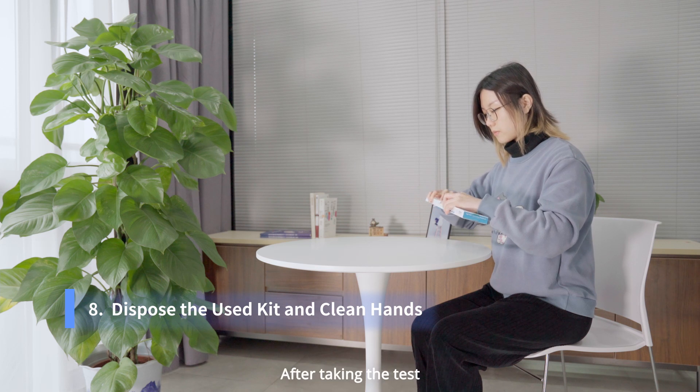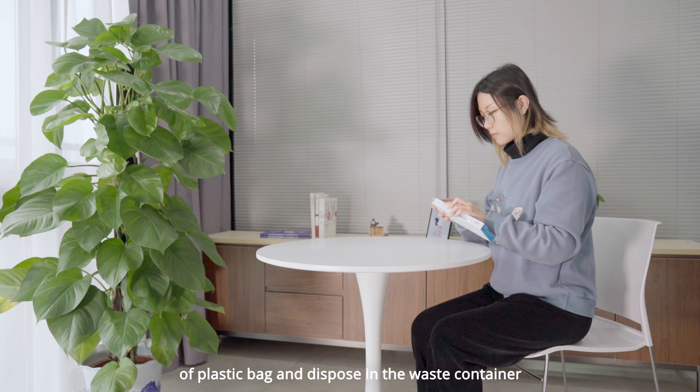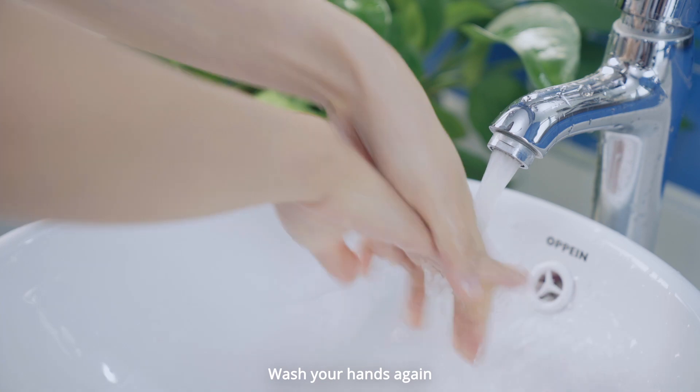After taking the test, seal all of the used components in two layers of plastic bag and dispose in the waste container. Wash your hands again.